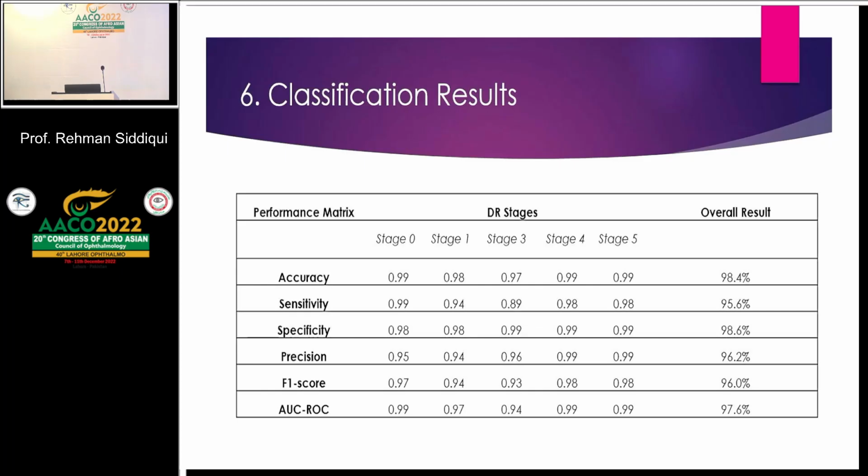The model is evaluated using different performance metrics which are tabulated here: accuracy, sensitivity, specificity, precision, F1 score, and area under curve. So here you can see that we have attained an overall accuracy of 98.4% using the proposed framework.